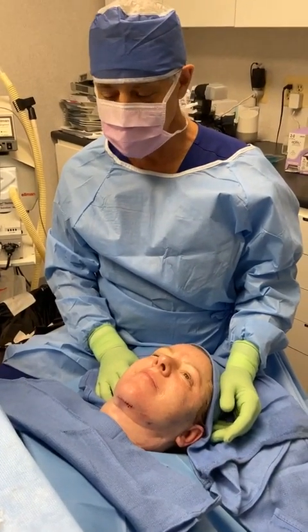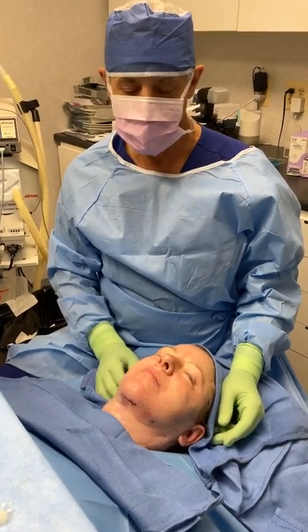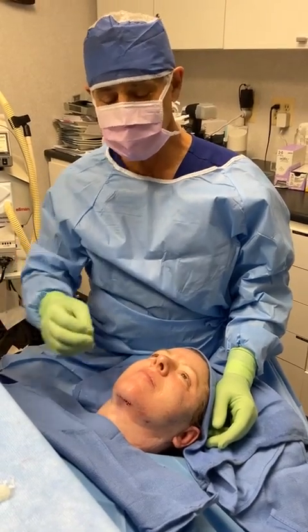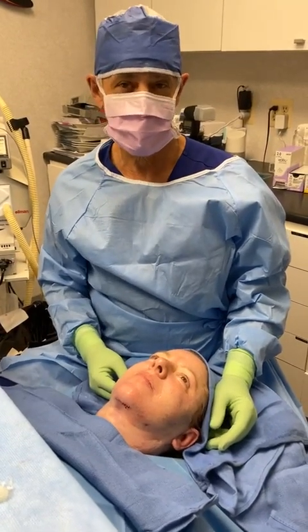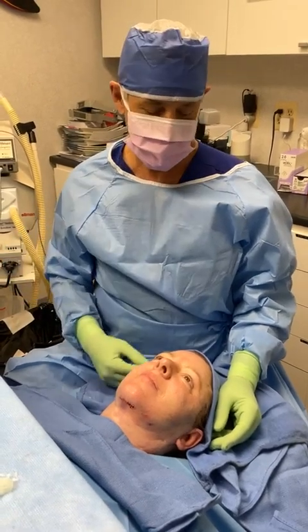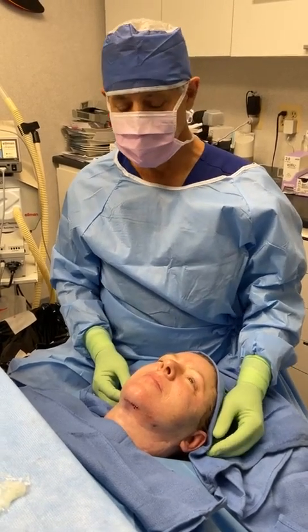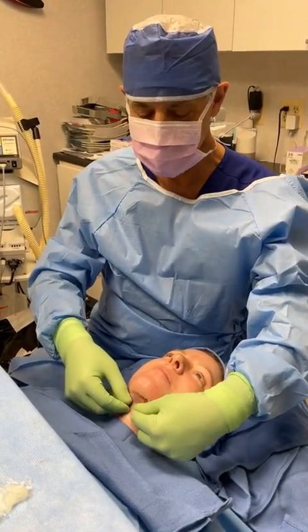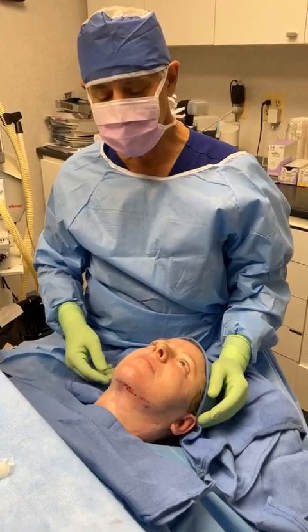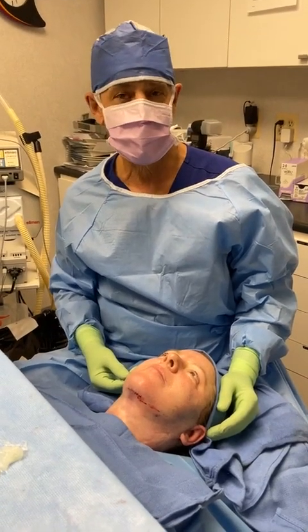Remember, this morning's project was to do a face neck lift and some tightening of the neck. That tightening part is known as a Central Corset Platysmaplasty. Also, if you'll see the previous episode, I did say maybe we would do a sling, and I did do a neck sling. There's some Gore-Tex that goes from side to side and then anchors behind the ears, and the reason for that is to get even more crispness of this angle.